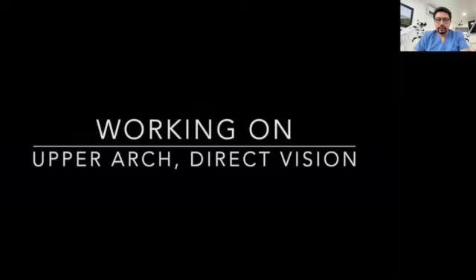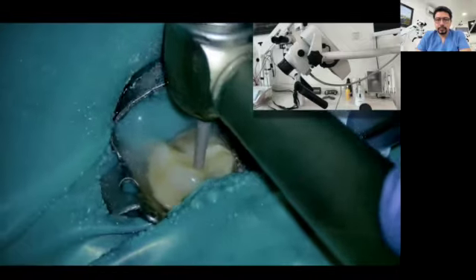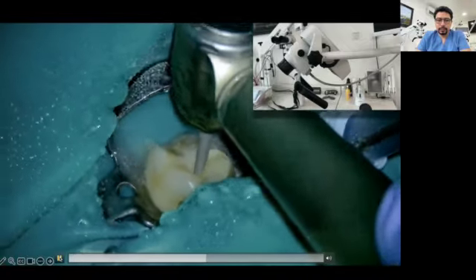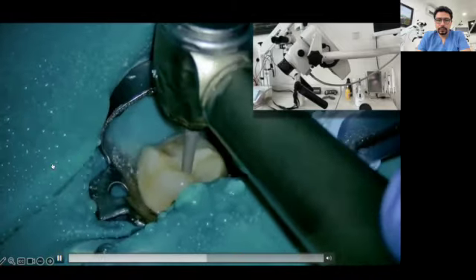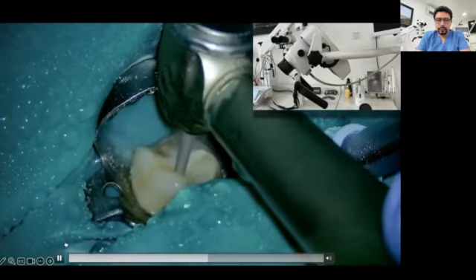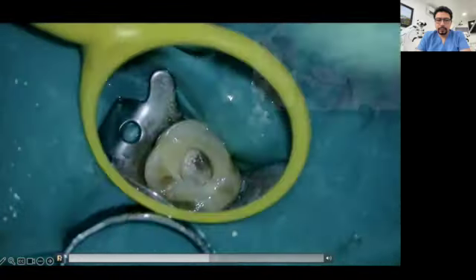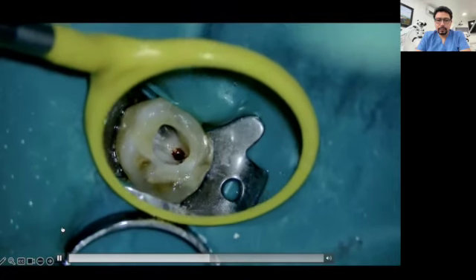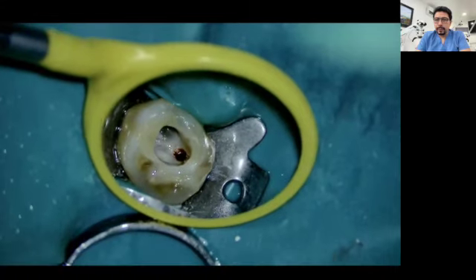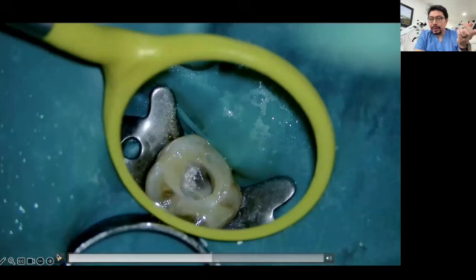Would you ever imagine doing an endo-access opening in an upper first molar with direct vision? Sounds crazy, but yes, it is possible. In this video, you are seeing an endo-access opening being performed with direct vision in an upper first molar. Then you just need to use the mirror for checking that everything is okay at the level of the pulp chamber floor. That's what I mentioned to you.